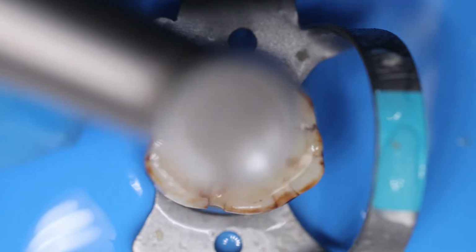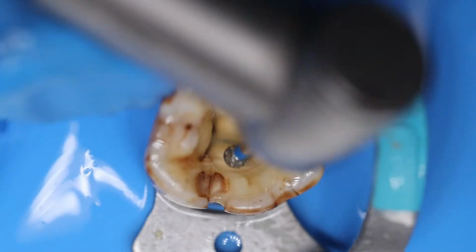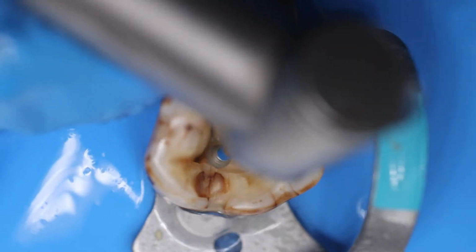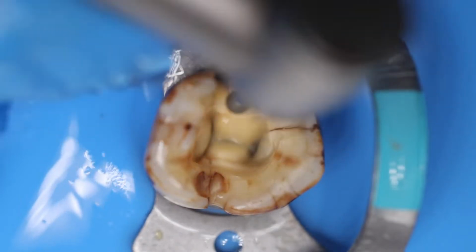Now we have almost removed the weakened tooth structure that was there. Do not run this round burr or any other diamond burr straight into the pulp chamber. It will lead to perforation. Okay, I am just using it against the wall to refine it. You can definitely use the endo Z burr, that is the safest burr that you can use against the wall.